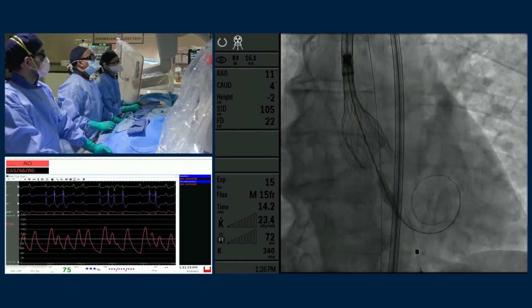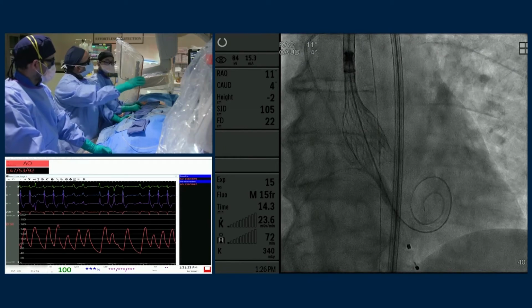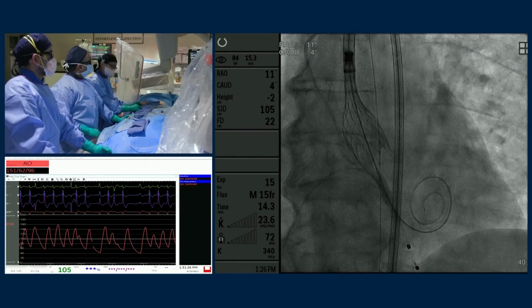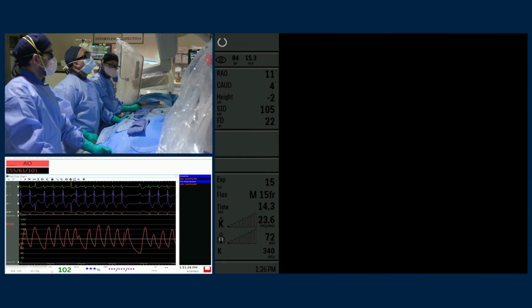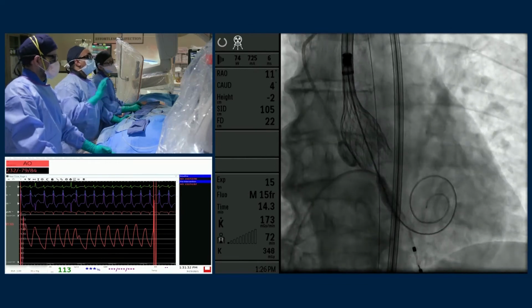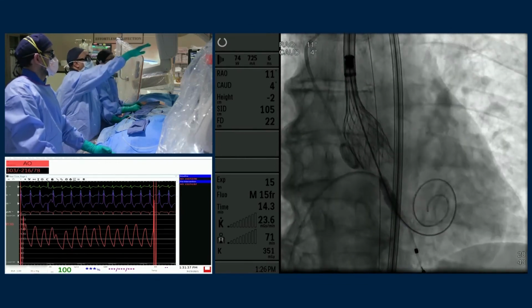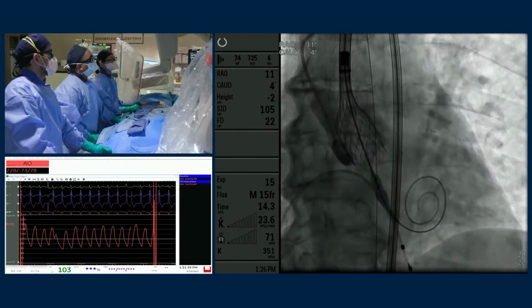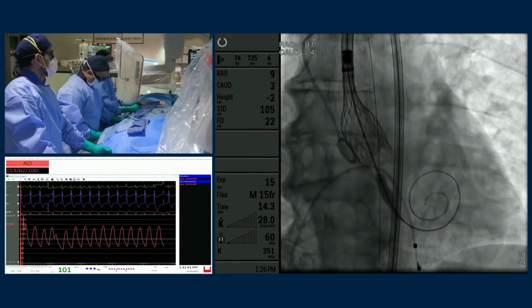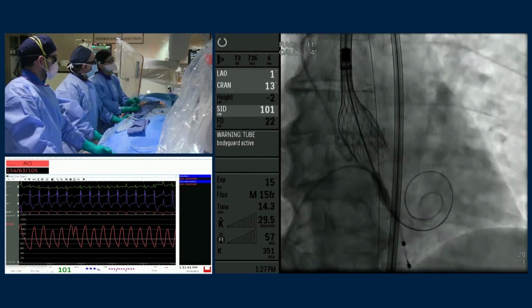Let's see. Okay, so let's do a little aortogram here, and then we'll go into an LAO view and to our coplanar view. Okay, go ahead. Ready? Yeah. Little puff. Good, looks good. Stop there. I really like that. You can see, you know, we're fine on the non. We're a little lower on the left, which is kind of what we expect. Let's go to our coplanar view, and then maybe we'll go to an LAO as well.